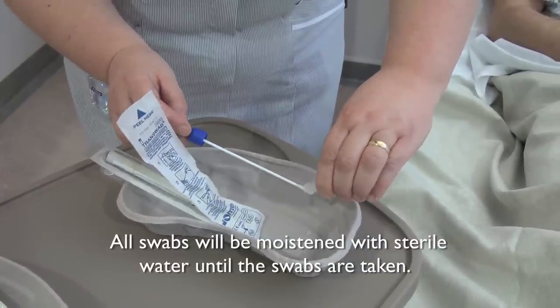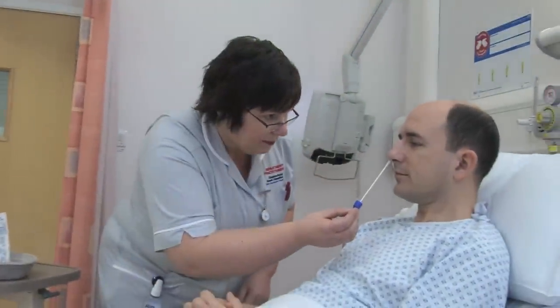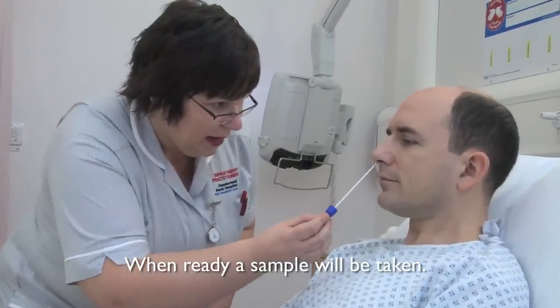The nurse will then explain to you what is about to happen and answer any further questions about the process you may have. When ready, a sample will be taken.